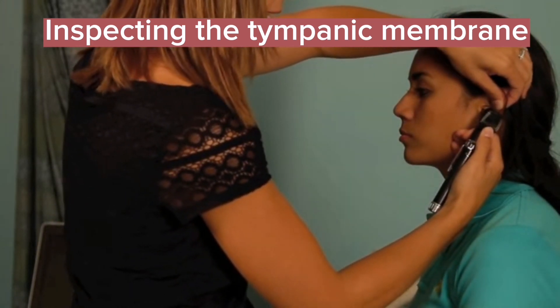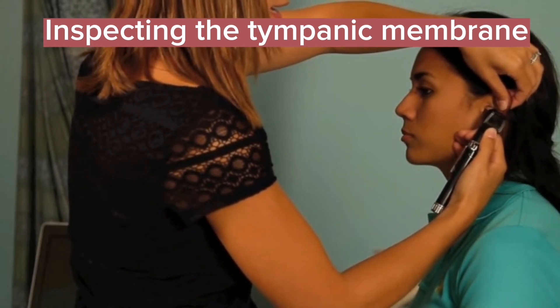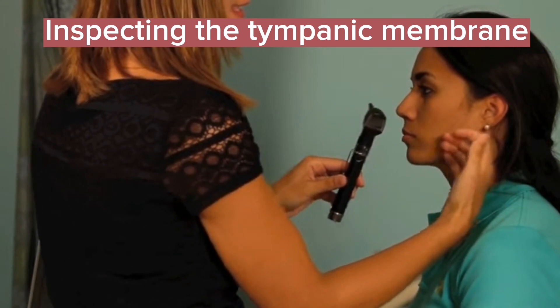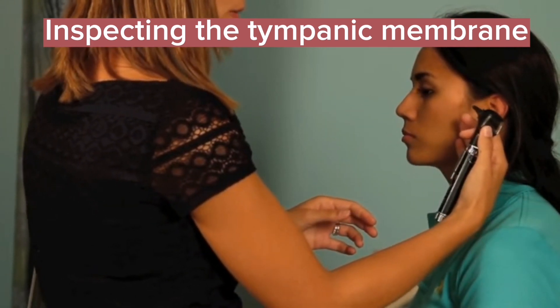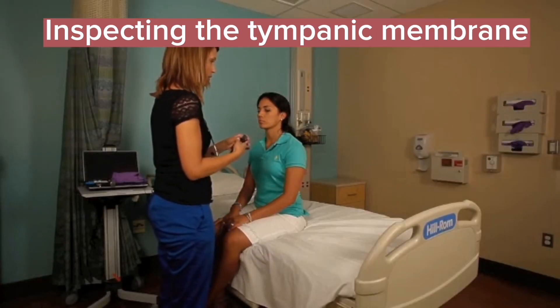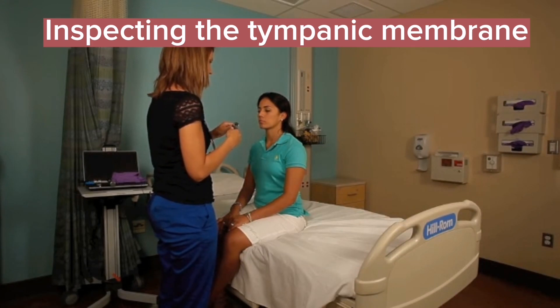Note how I'm bracing — I'm pulling up and back with my left hand on her ear. With my right hand, the hand that has the otoscope, I'm bracing against the side of her face. I do this so that the scope isn't going to get out of my hand and jam into her ear, which is very uncomfortable. This is really important when you're seeing pediatric patients, as they're constantly moving their heads, and you don't want to cause any trauma to their external ear canal.